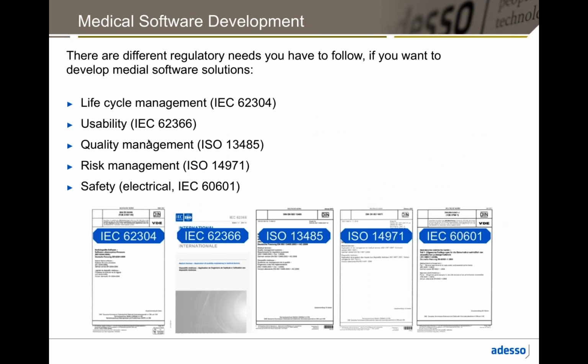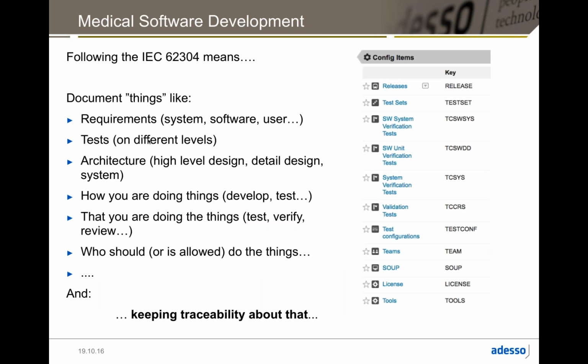When you are developing a medical software solution, you have to keep in mind some of the regulatory norms you see here. For example, lifecycle management, usability, quality management, risk management, and if you have real hardware, you also have to follow some electrical requirements for your development process. Let's look a little bit at the 62304 regulatory norm.